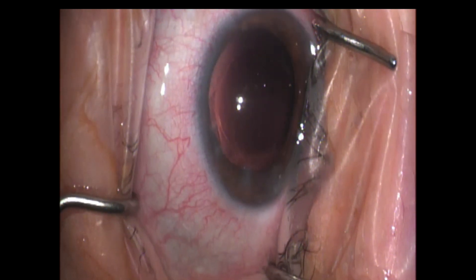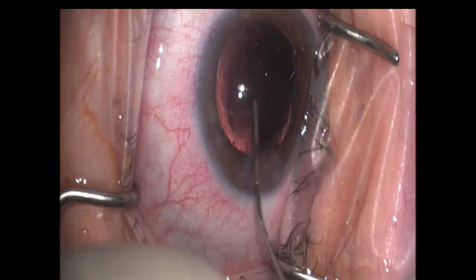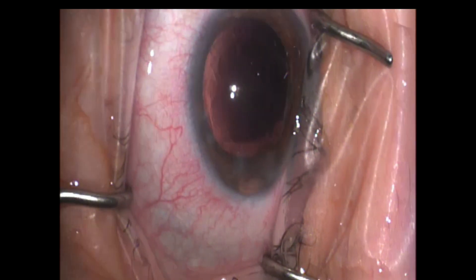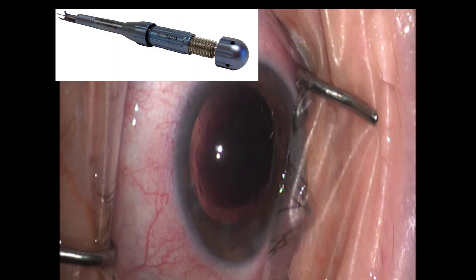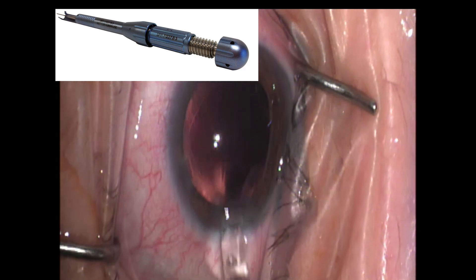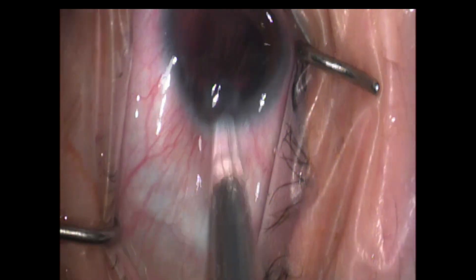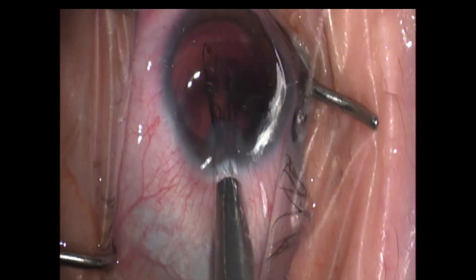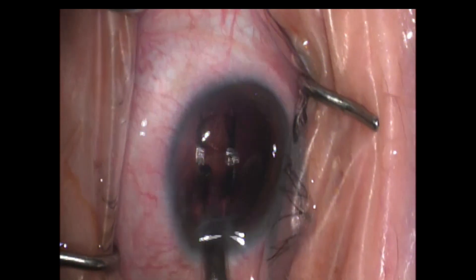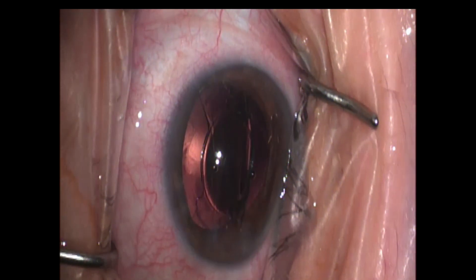Now we're polished. We've got a good, nice opening and the complete cataract has been removed. We're re-inflating with our cohesive viscoelastic — ProVisc in this situation. Now you're going to see me bring in the Bliss injector by Bausch & Lomb to put in this MI60L lens. This is not the classical injector you would use for this lens, but if you load up that lens nicely, it can very easily be pushed through without damaging the lens at all. You don't need a special injector to make this happen.